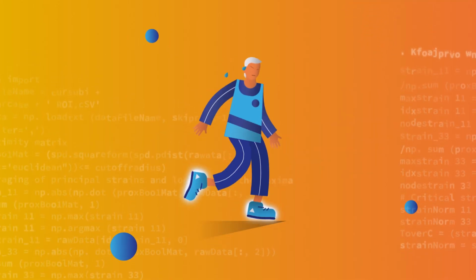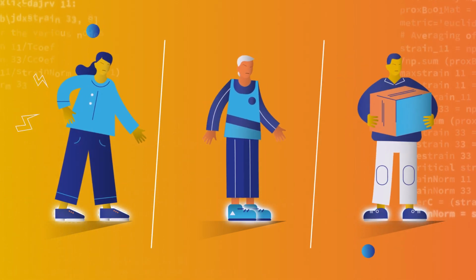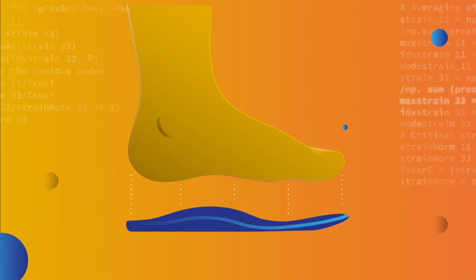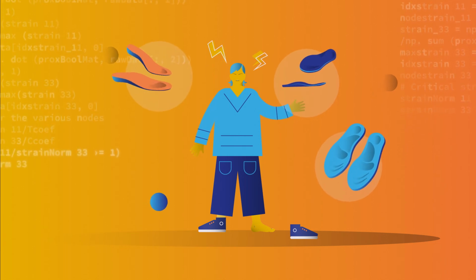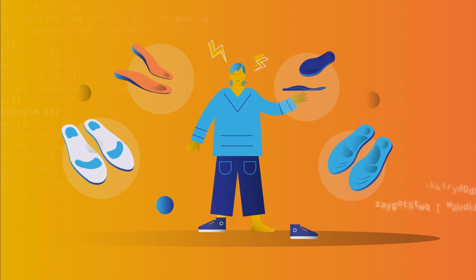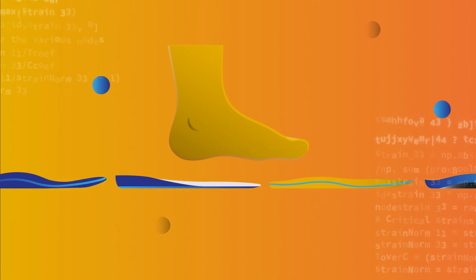Corrective insoles are used worldwide to treat different foot pathologies, improve movement during daily life and sports, or enhance comfort. Much like finding the perfect shoe for an outfit, finding the optimal insole to correct specific foot pathologies or atypical motion can be just as difficult. While many options of orthopaedic insoles exist, they are often not customized for the individual patient.